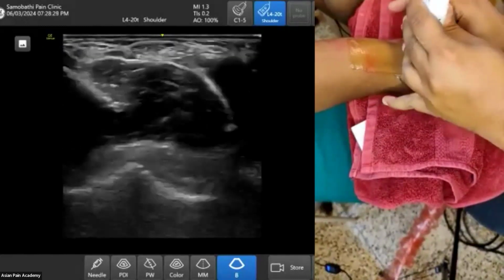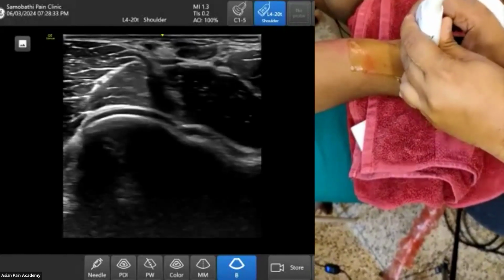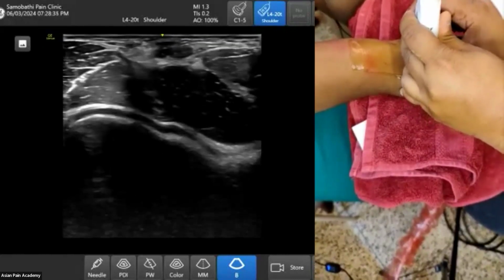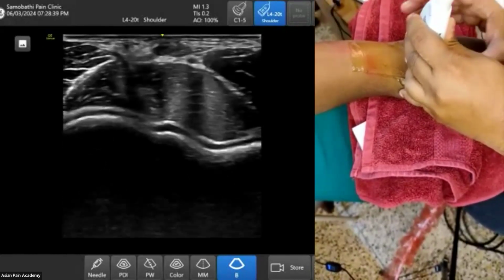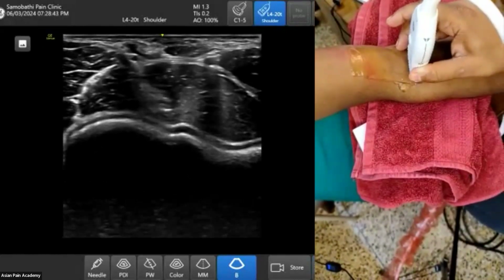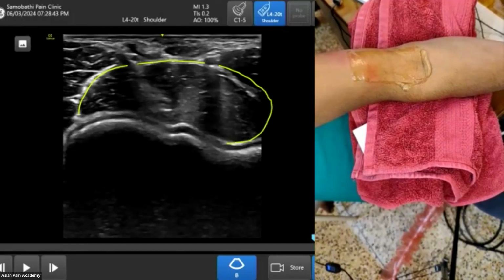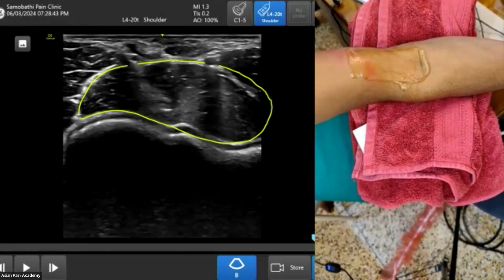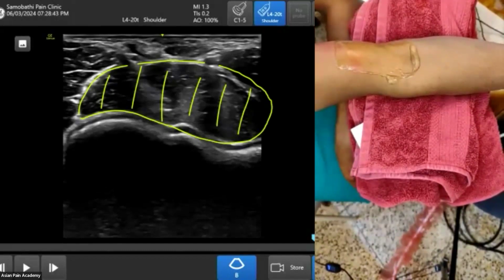And as we get this wavy margin, the muscles are now very clear. We have a big muscle just above this wavy margin. Let me stop and I will show after freezing. It is a very big muscle. See, this muscle is the brachialis muscle. Here, as I told, this is the large muscle.